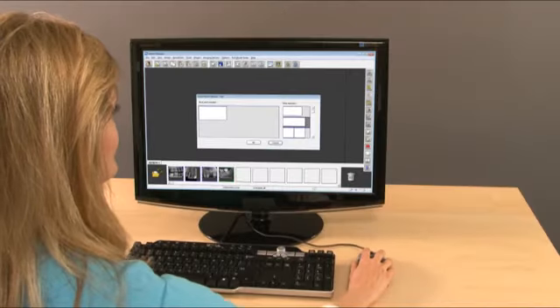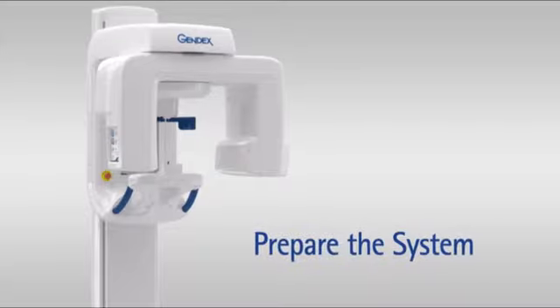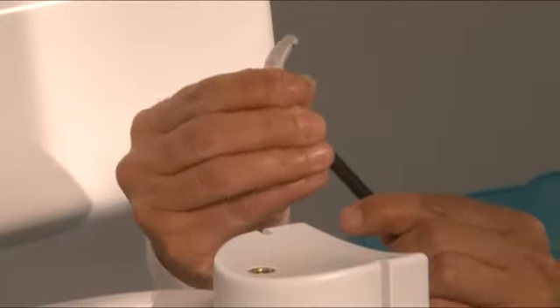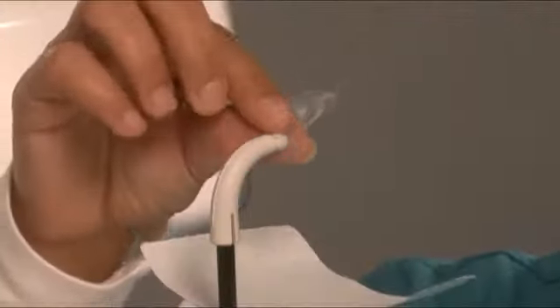Set up the acquisition from within your imaging software. Prepare the system. Push the chin rest into the support holder. Place the bite guide onto the bite rod. Place bite guide rod assembly into the chin rest. Then place barriers onto the chin rest and bite guide.